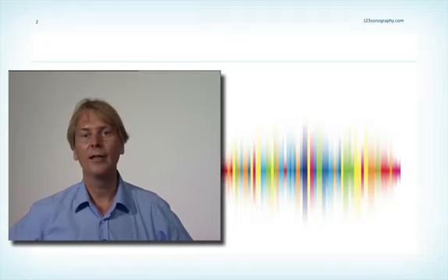In the mid-80s, when the first ultrasound machines came on the market which had color Doppler, most people actually thought it was a useless technology and that it would not have a great impact in echocardiography. Well, the reason was that the quality of the color Doppler spectrum was not very good. That has changed, and nowadays there is no way we can perform echocardiography without using color Doppler.